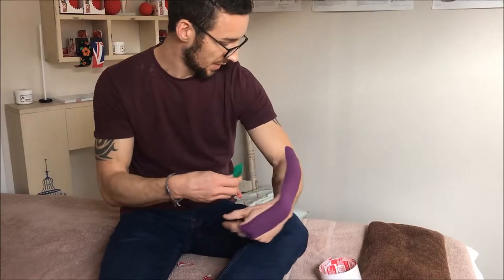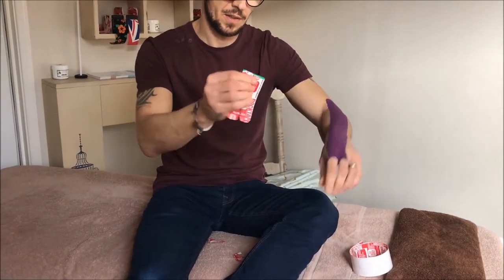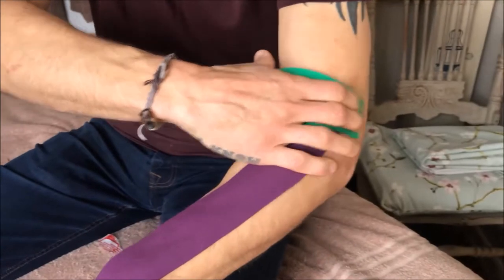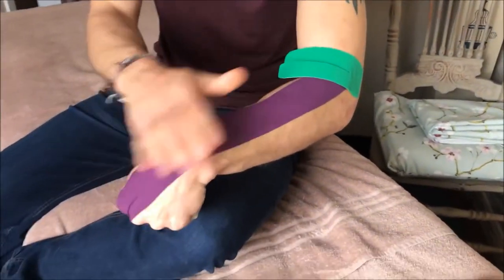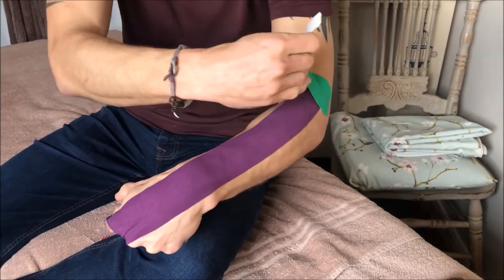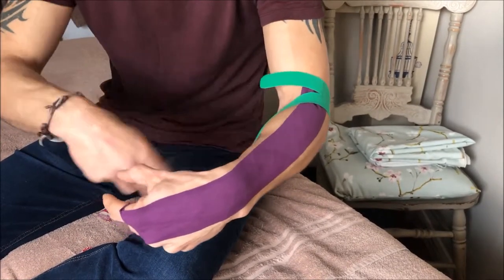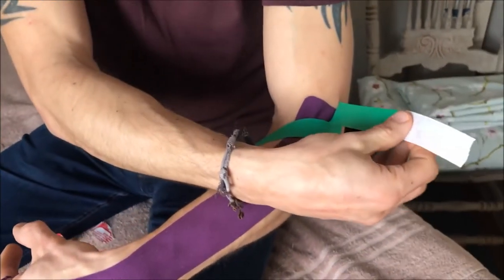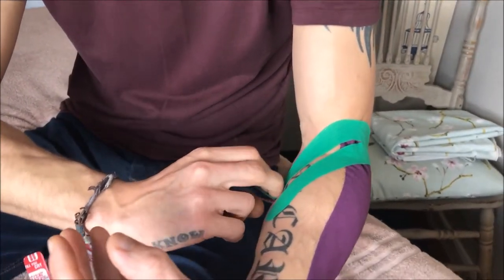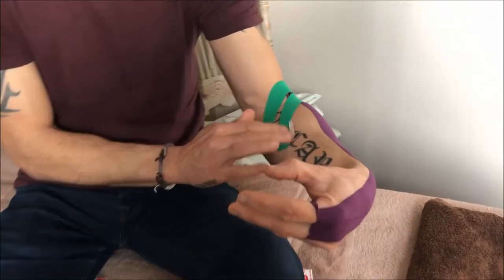Keeping the wrist flexed, take the second piece of tape, rip off about an inch from the end, and come in behind the end of the first strip. Flex the elbow and wrist slightly. Give the strips a tug to break them and apply at 70 to 100% stretch, pulling up and wrapping down onto the inside of the forearm. Finish the end tab with no stretch at all, then activate the glue.